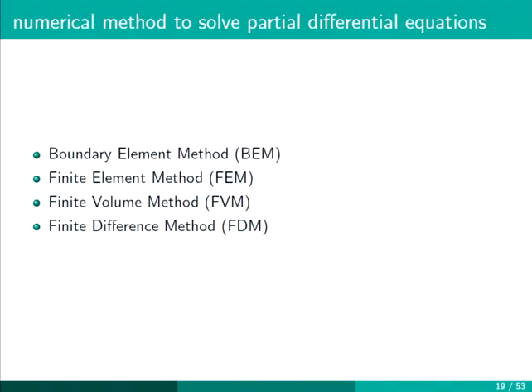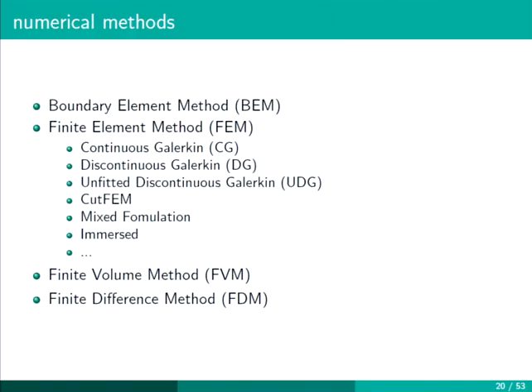Within the big family of the FEM, there are sub-families. For example, the standard FEM can also be called continuous Galerkin FEM. There is also a discontinuous Galerkin, unfitted discontinuous Galerkin, CutFEM, mixed formulation, immersed, and all of these methods have so far been employed for solving the EEG and MEG forward problem, or EEG for sure.